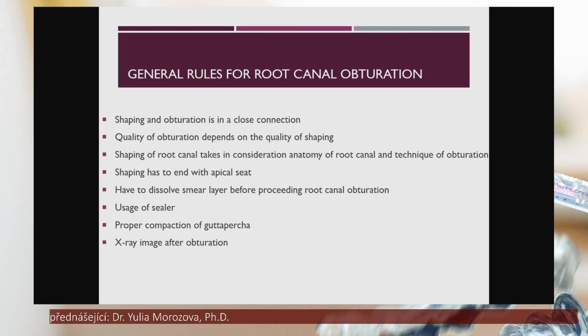We should create this taper shape, and we should prepare the apical seat of the consequent root filling. Also, when we provide the shaping of the root canal, we should keep in mind the anatomy of the root canal and the technique of consequent obturation. Before the root canal obturation, we should dissolve the smear layer, we should remove the remnants of dental pulp, so we should provide adequate, perfect root canal irrigation and disinfection.